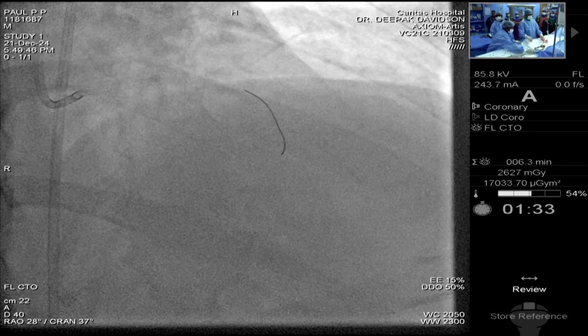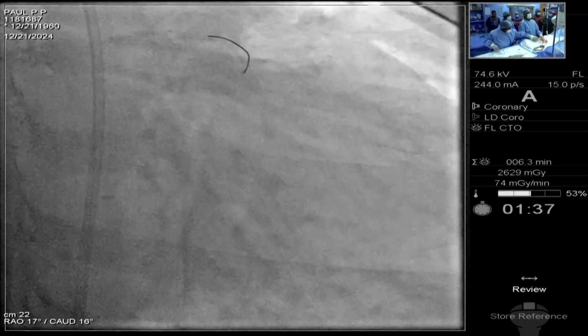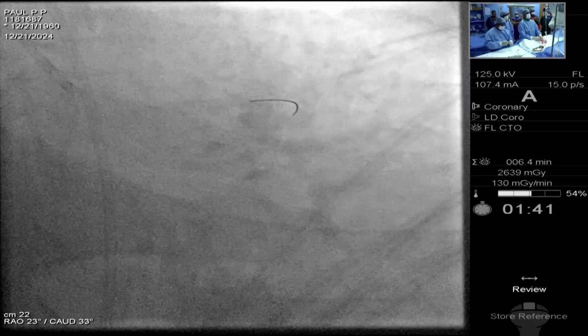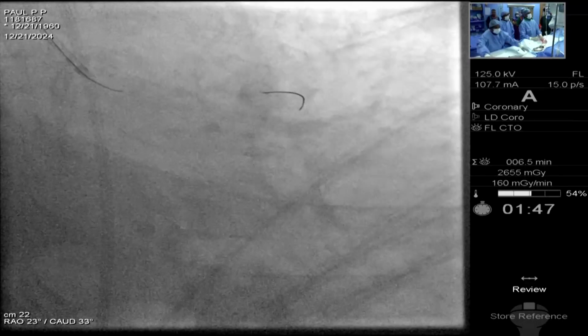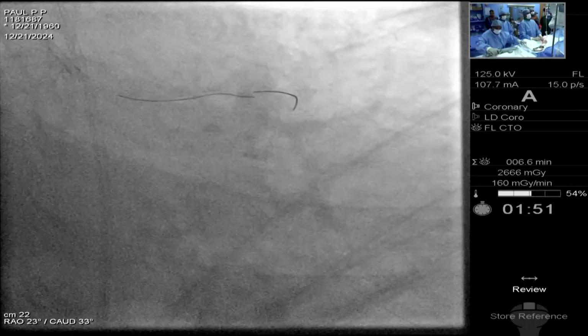Can you come caudal? Okay, come cranial.